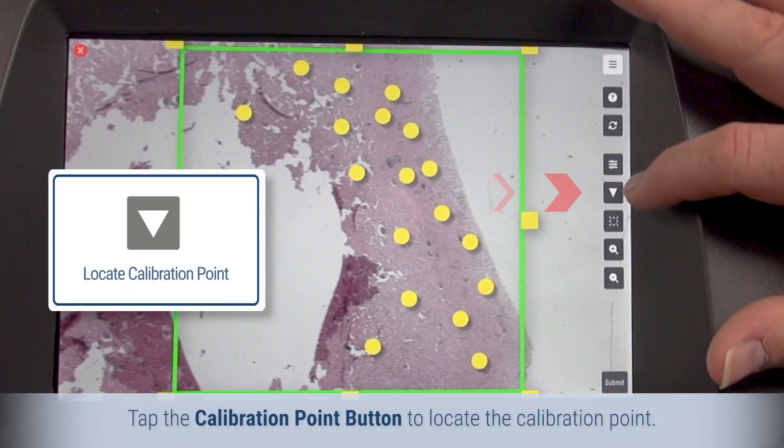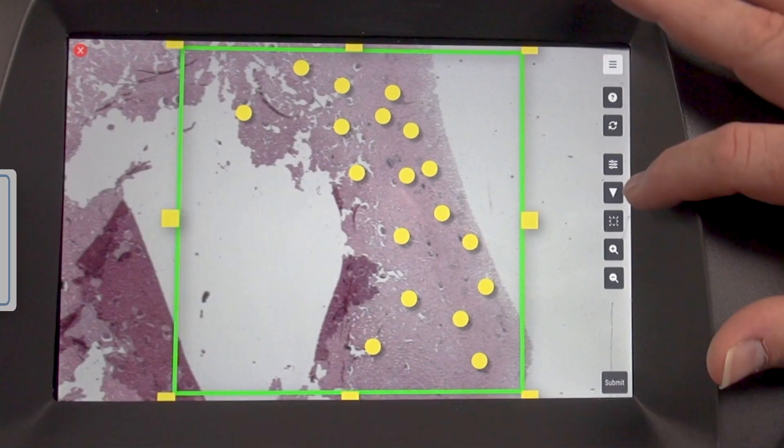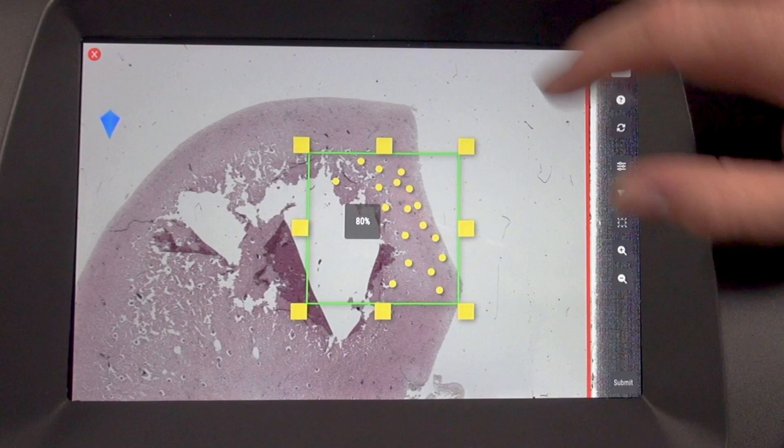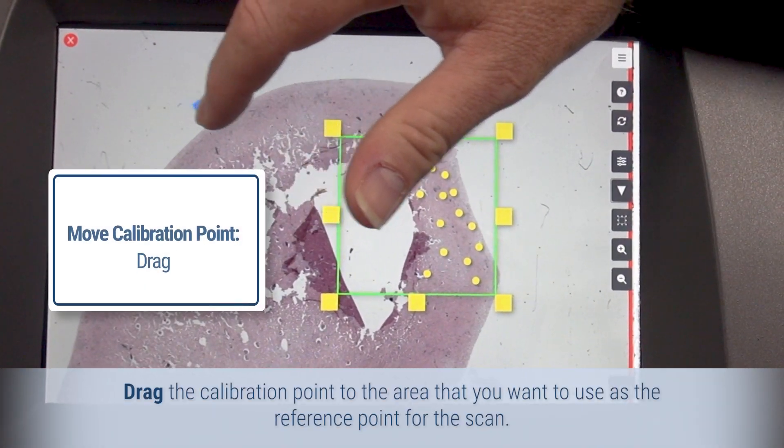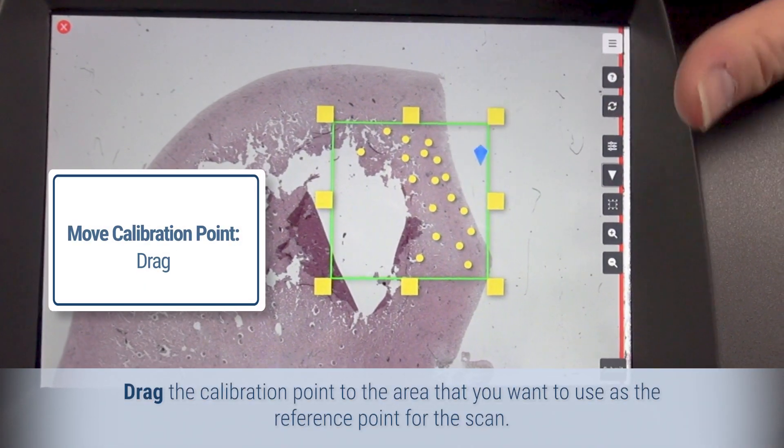Tap the calibration point button to locate the calibration point. Drag the calibration point to the area that you want to use as the reference point for the scan.